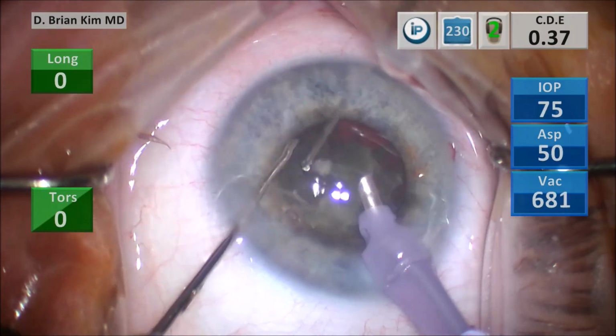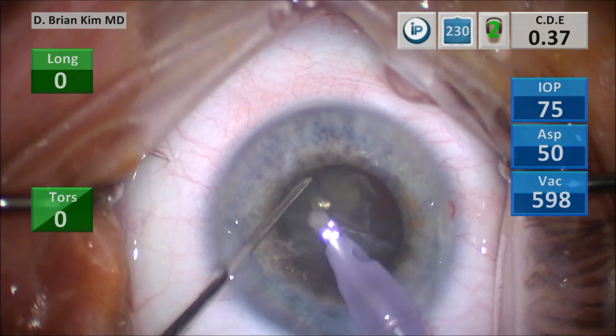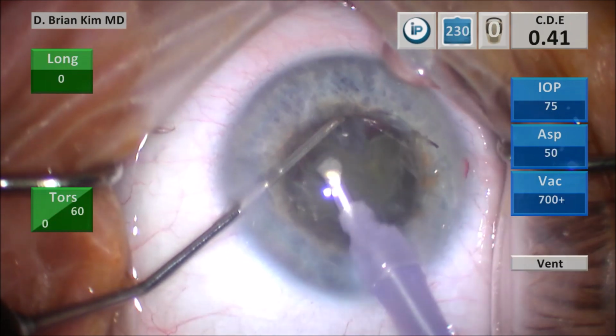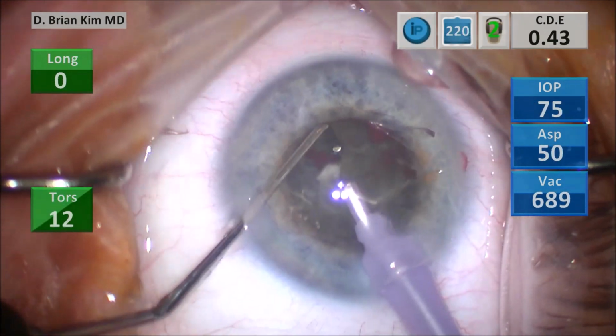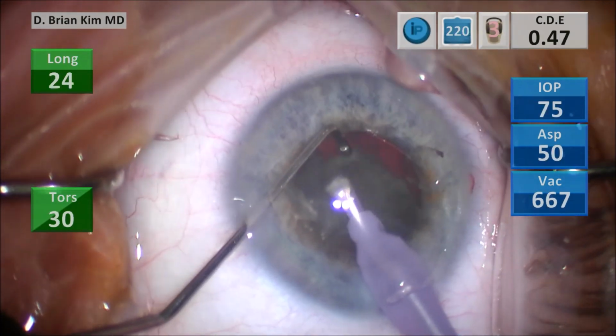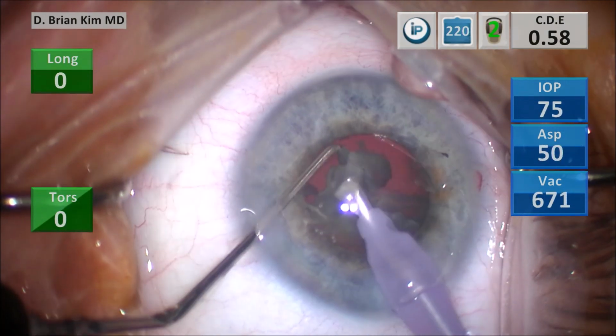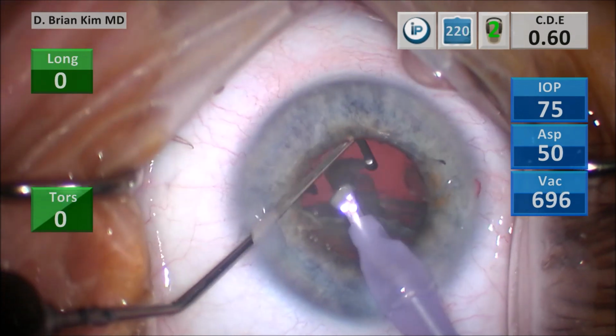And now that the pieces are small enough, it's mobilized the lens piece out of the bag, and I'm able to use mechanical fracturing forces to crush the remainder of the lens pieces. But again, despite this not being a really, really dense lens, it's just very sticky, so it just makes it much more cumbersome to disassemble this lens.